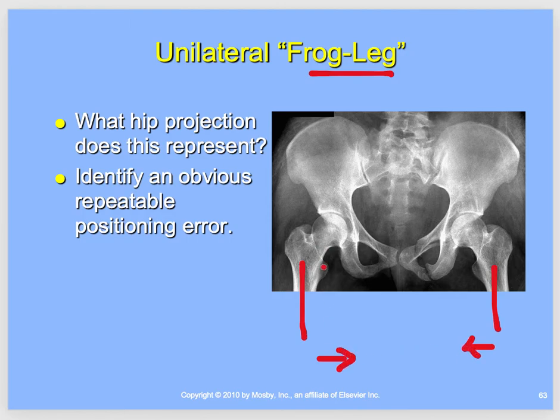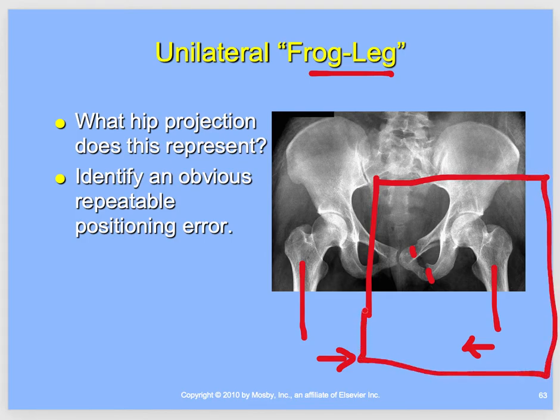So we're seeing that lesser trochanter. We're seeing that greater trochanter over top of the neck and the head of the femur. So rotate those legs in 15 to 20 degrees. Also, since we took this AP pelvis, we can see a fracture right here on the superior and inferior ramus. So that may prevent us from rotating this leg in. Just see what your patient can do and then take the appropriate image for the AP pelvis, and then if it is a frog leg, make sure that you cone down to the appropriate frog leg and make that image.